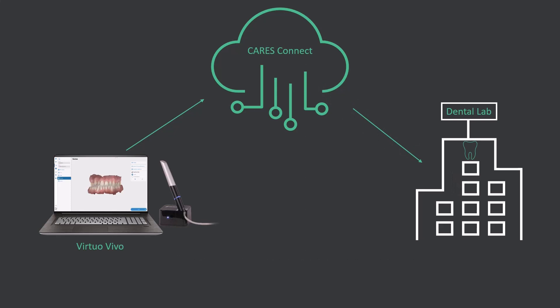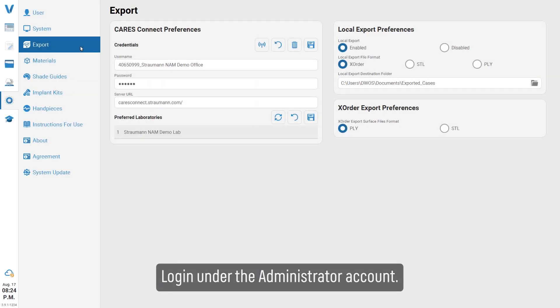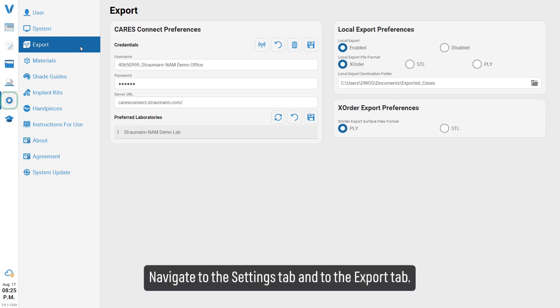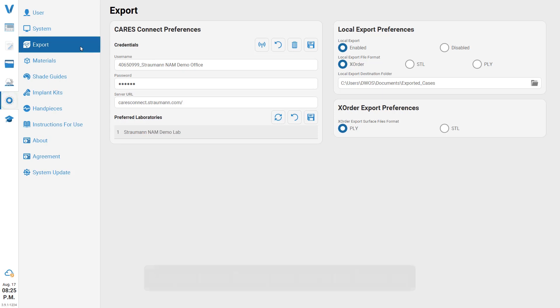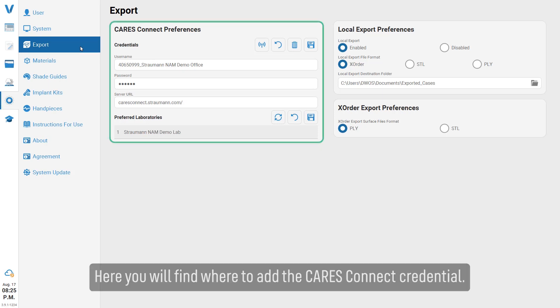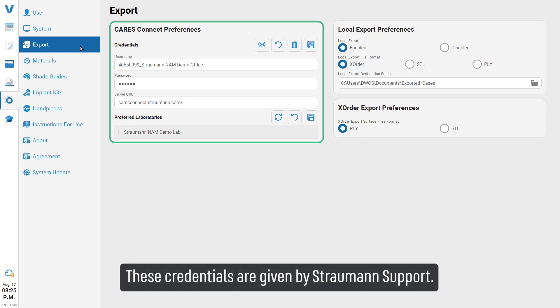Log in under the administrator account, navigate to the Settings tab, then to the Export tab. Here you will find where to add the Cares Connect credentials. These credentials are provided by Straumann support.